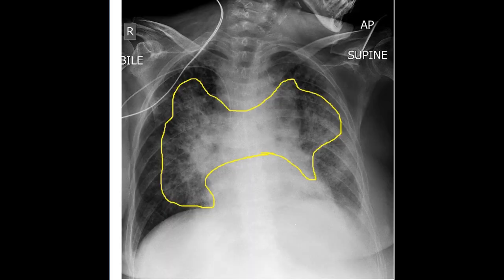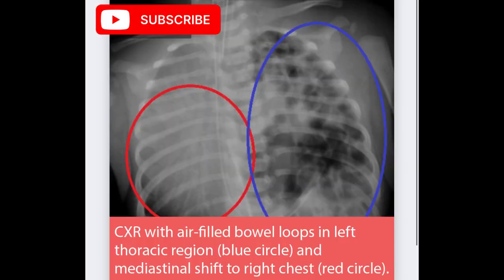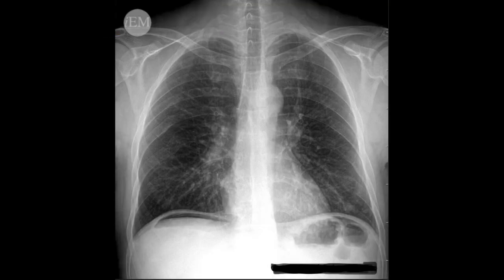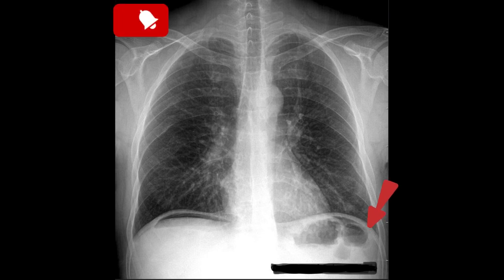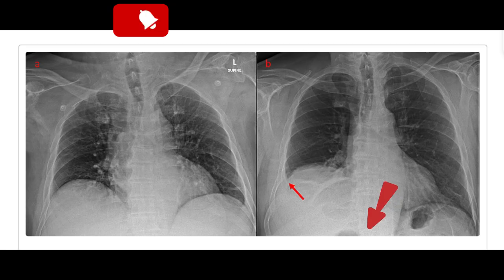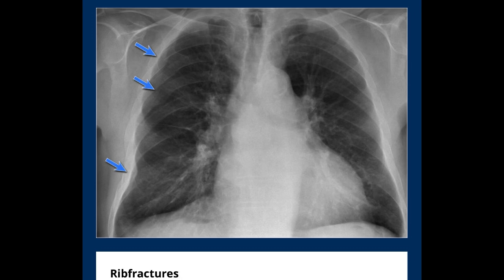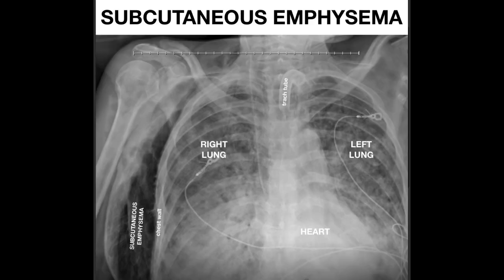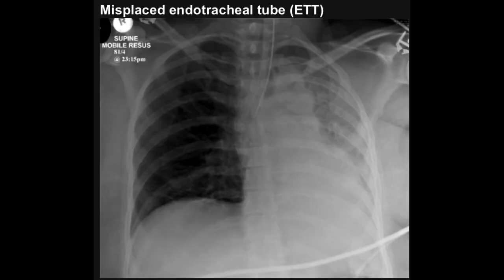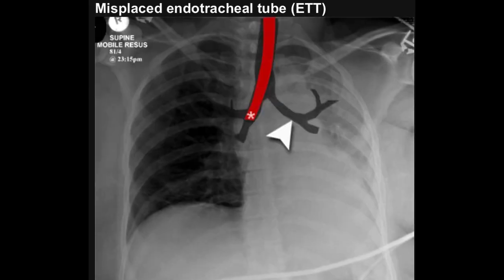For the diaphragm: if bowel loops are seen in the chest X-ray, there must be a hernia. Free air under the diaphragm indicates a perforated hollow viscus. A raised hemidiaphragm should raise suspicion for collapse, phrenic nerve palsy, or a subphrenic abscess. Finally, for everything else: check for any bone fractures, subcutaneous emphysema, and device malposition. In a patient with an endotracheal tube, if it is too deep into the right main bronchus, there may be a risk of left lung collapse.